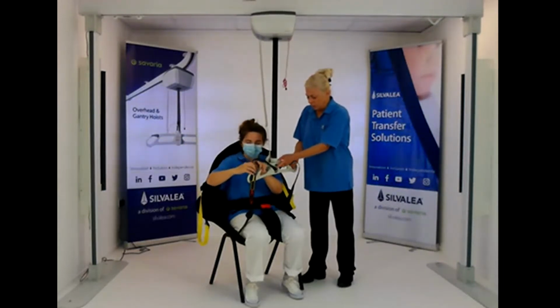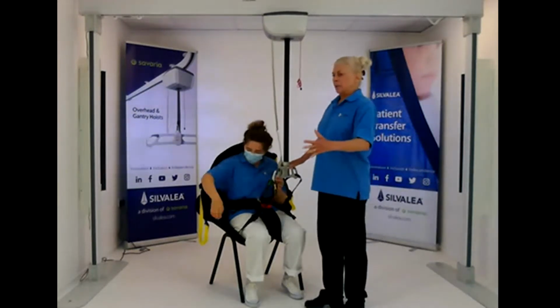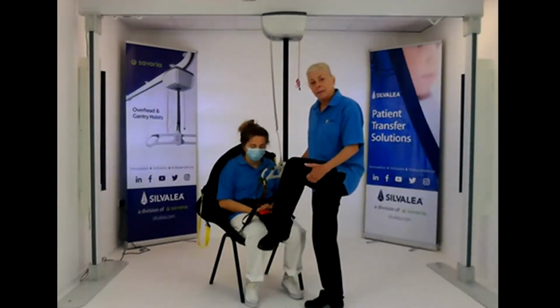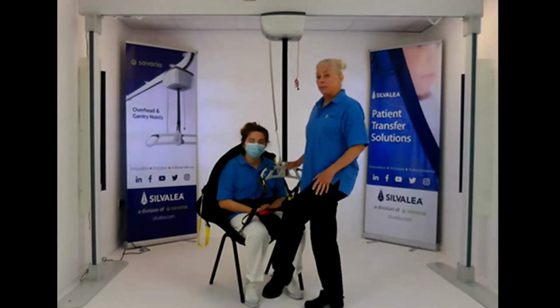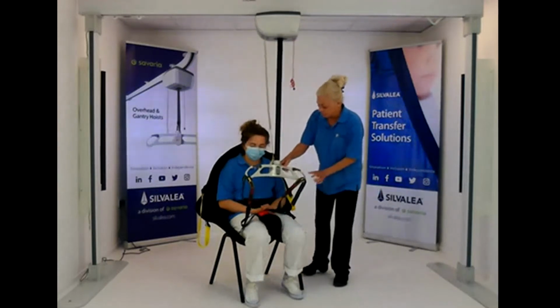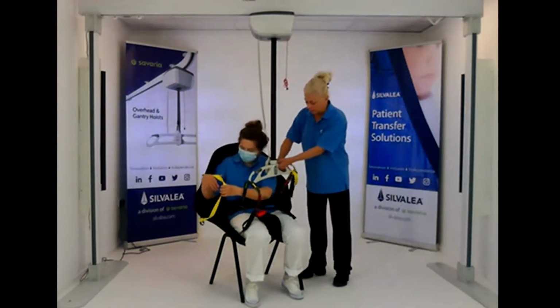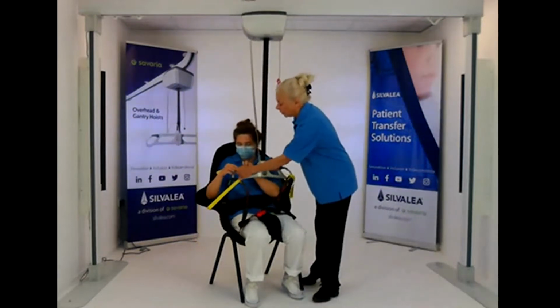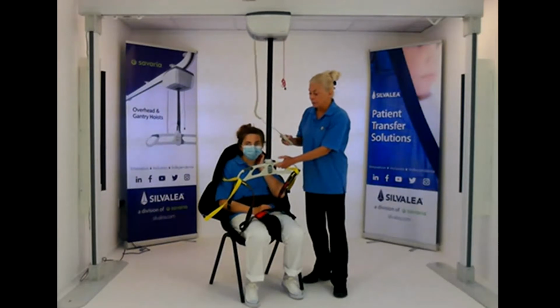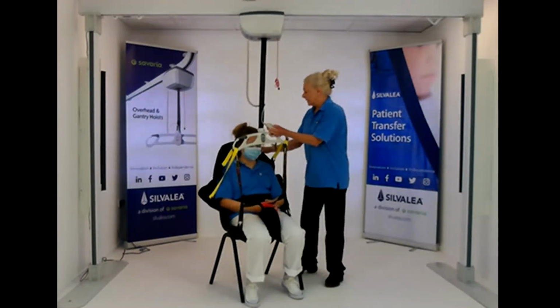I always find that when you've got an extender, somebody that really wants to extend and push, shorten the legs a little bit. If they're too low, then it helps to extend. So try to break up that position there. So I've got a shorter leg. And again, the counterbalance goes on last. So if we've only got one hook on the spreader bar, then it will allow movement.